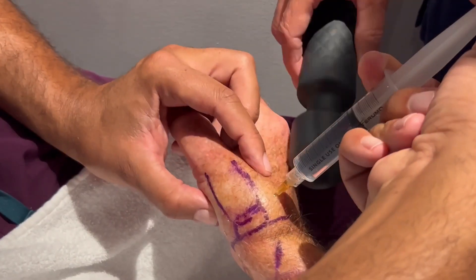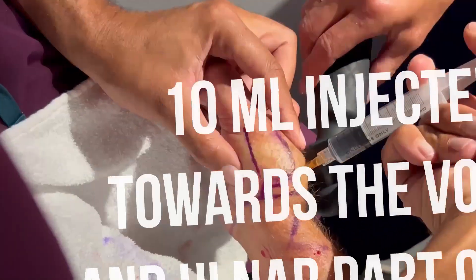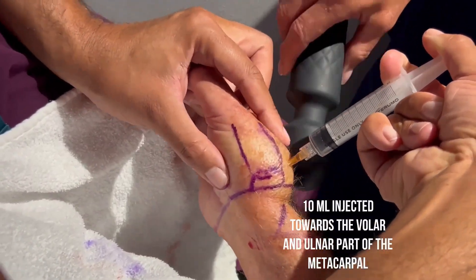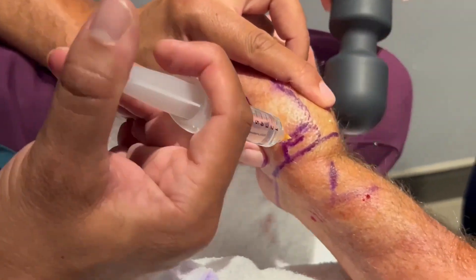And then we're going to do the same thing on the ulnar side, aiming to reach the ulnar side of the metacarpal bone.